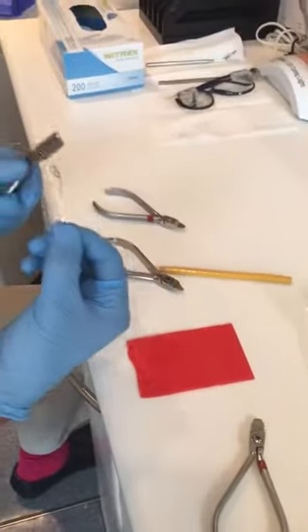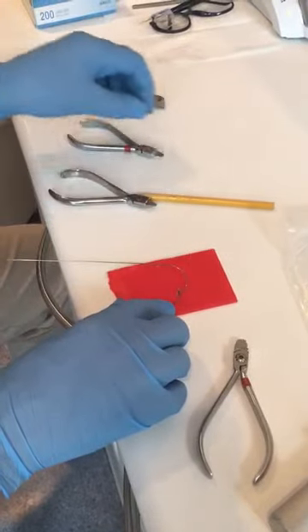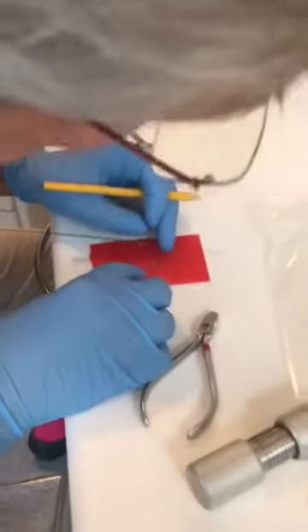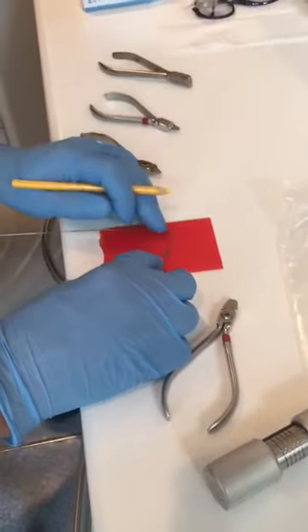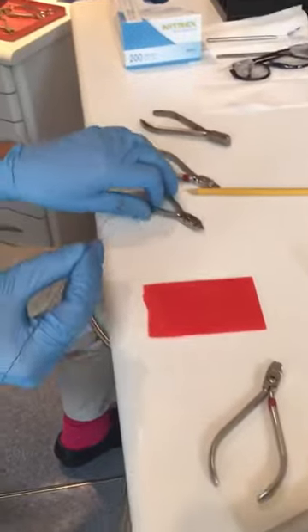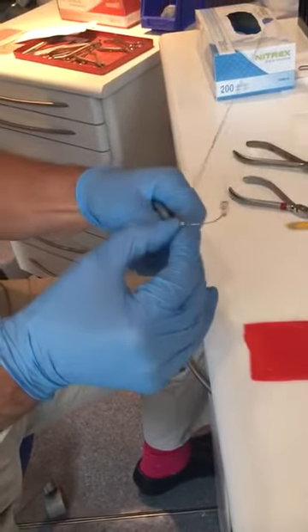So we've done 1/2 of the double delta now, and the important thing is to mark the wire for the second bit, so that you've got room to activate it. So we want that coming around there. So we want that a little bit further forwards there. And then it's a matter of doing exactly the same bends. So we do the vertical bend first.